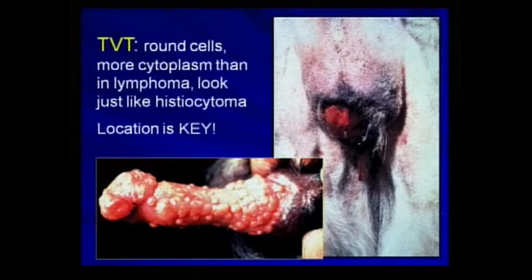And this is what they look like grossly. These are very interesting neoplasms. They have only 59 chromosomes. During transfer from susceptible host to susceptible host, they do not exhibit major histocompatibility antigens, and over time these will regress, just like those histiocytoma.